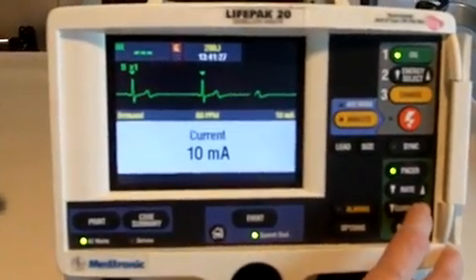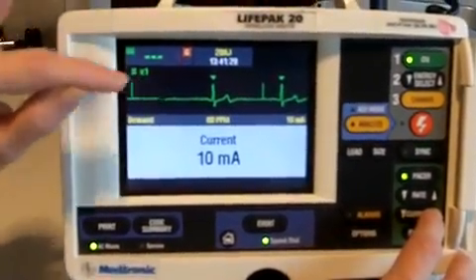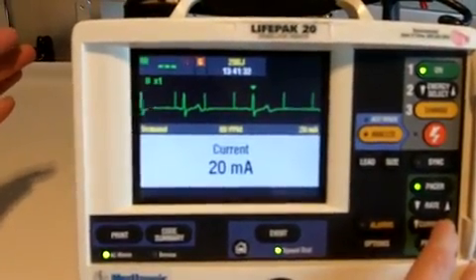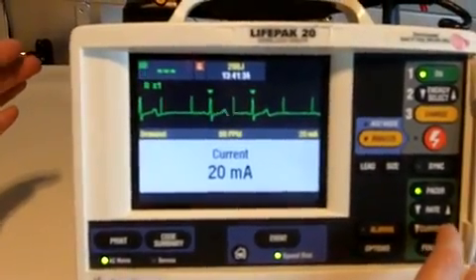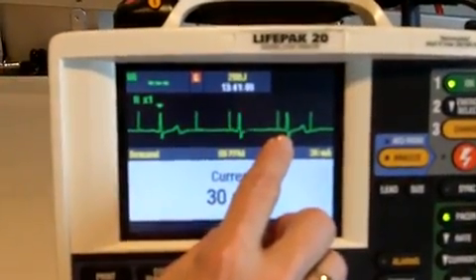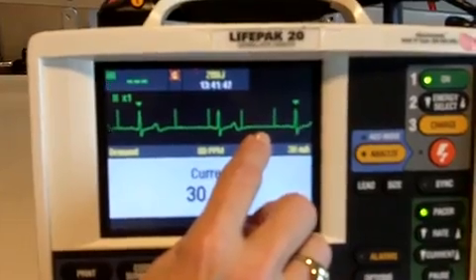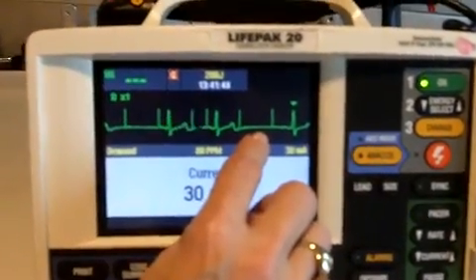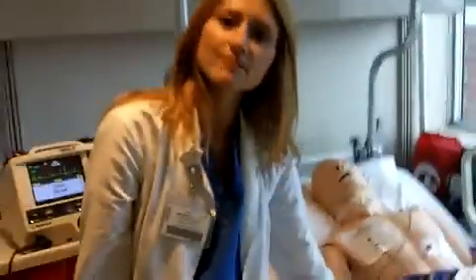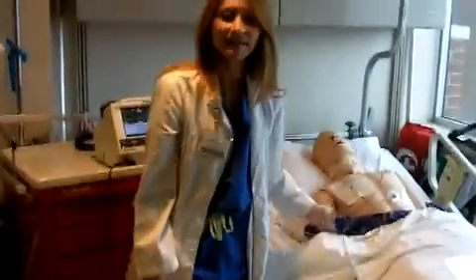I'm going to dial up until I see a spike followed by a QRS. I start low and continue to go up until I see capture. Here I have a spike followed by a QRS complex, which means my patient responded to the pacing energy. I want to check the patient's pulse to make sure it's adequate, and that's my transcutaneous pacing.